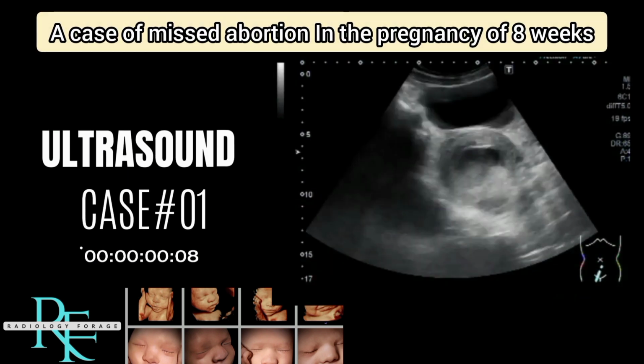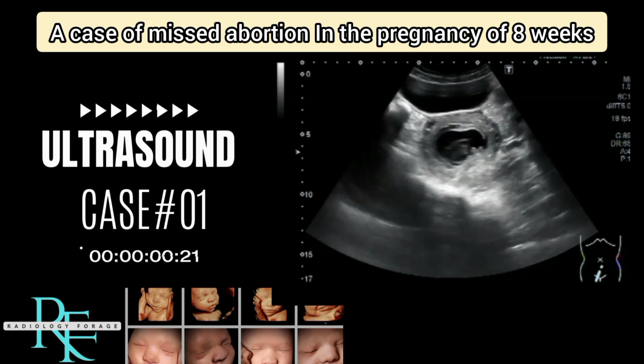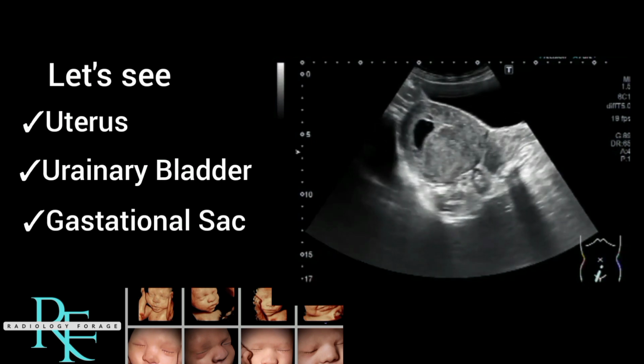Let's start this lecture. Today we will discuss a case of missed abortion in the pregnancy of 8 weeks. Now we are going to see uterus, urinary bladder and gestational sac.